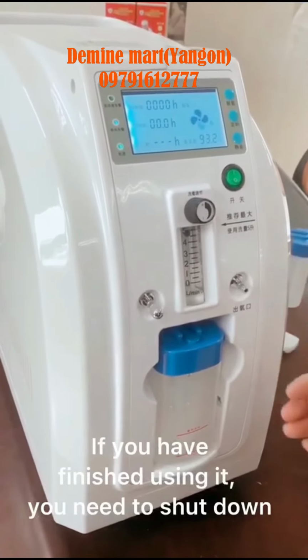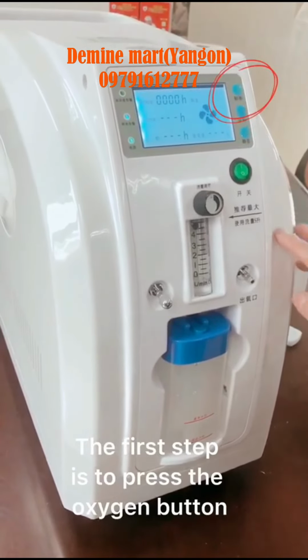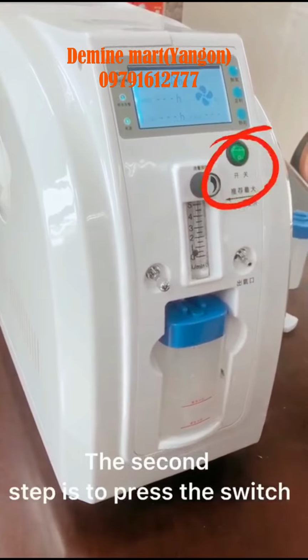If you have finished using it, you need to shut down. The first step is to press the oxygen button. The second step is to press the switch.